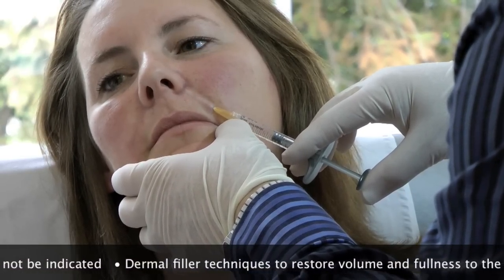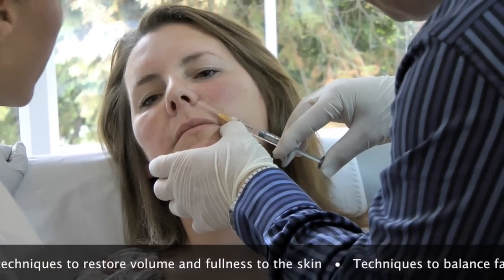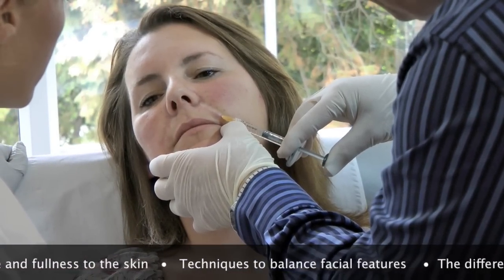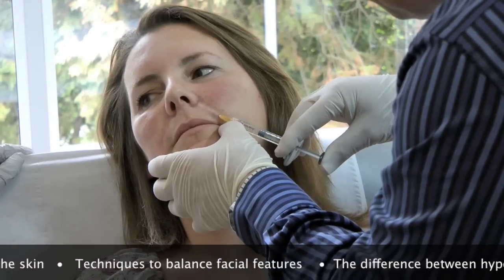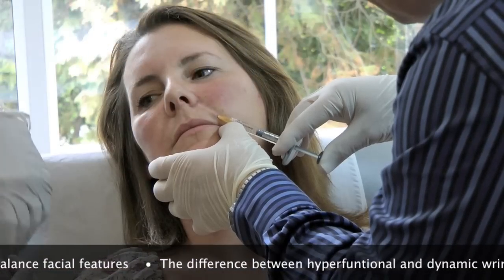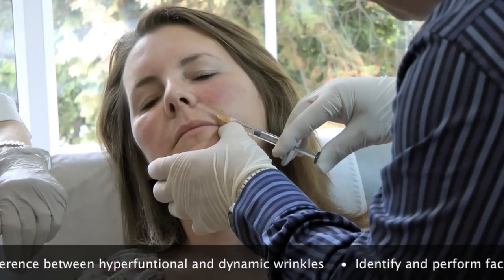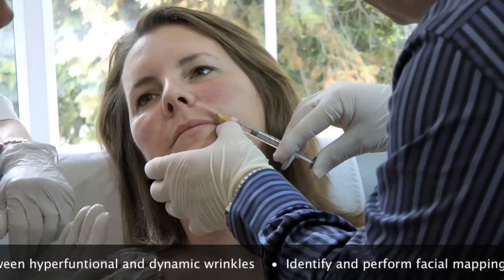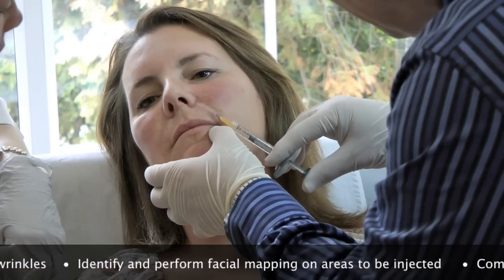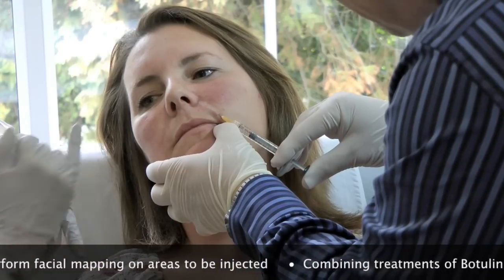So you're watching the skin to see if you get any blanching or any flushing. You can get a little bit more into that area. You can just lift the needle for me. You can just bring it slightly lower to the right. That's it. Super. Sometimes you need to fan in that top area.